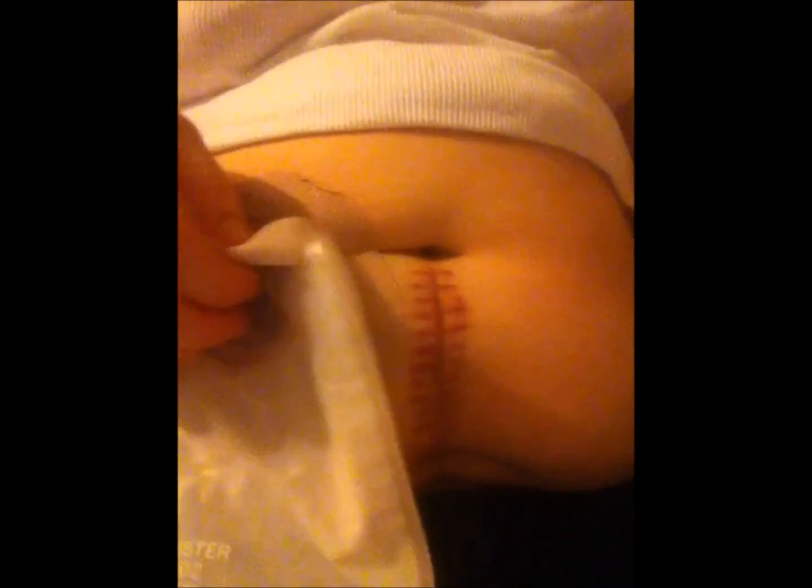I'll be wearing this for 3 days, probably 2. Then I'll change it. I'll just take it off and put another one on. And I like the convex because I really do need my ostomy to stick out. Now, just like I said, this is my ostomy belt hooks. I hook it right there. If I can do it. I hook it there. It goes around my body. And then I hook it again. And it really just holds it in really tight.